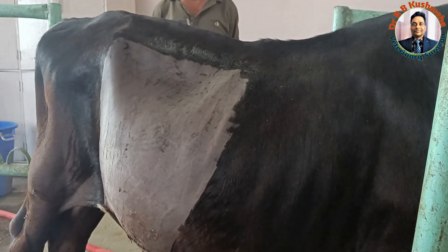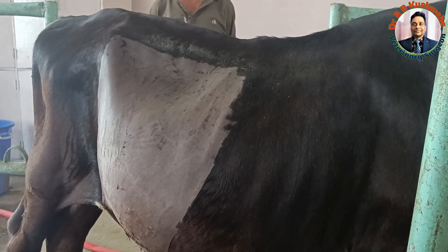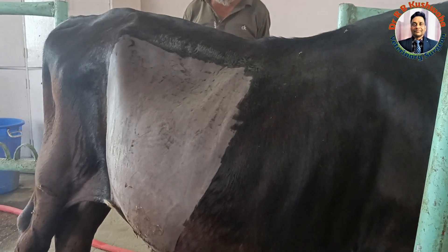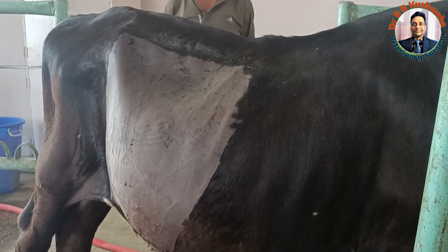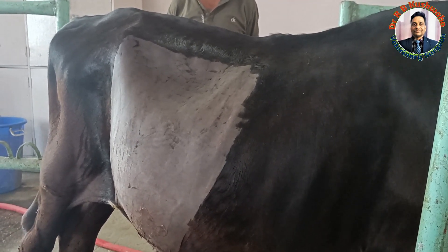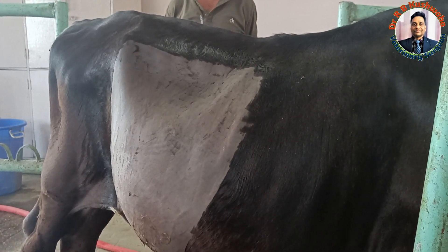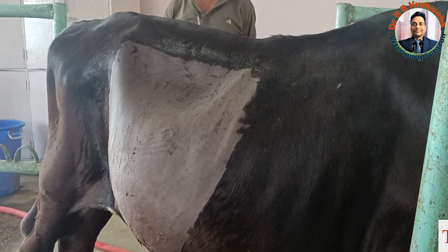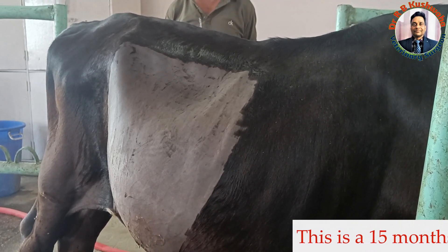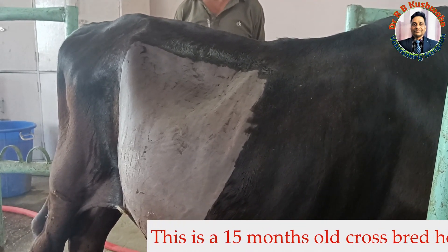Today we have a case of a cow. We are suspecting intestinal obstruction in this case. The history of this cow is that the animal has not been passing dung for the last four days, and also had a colic sign four days back. The animal is also not taking any feed and fodder.